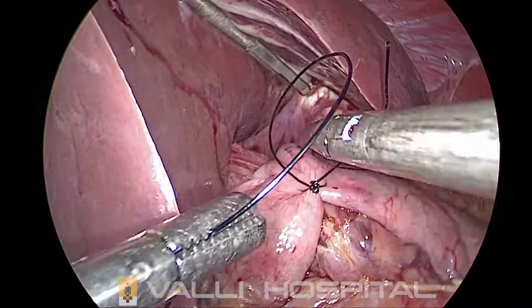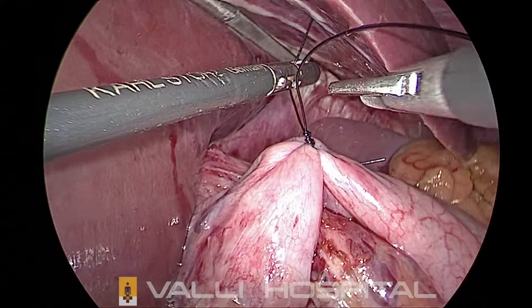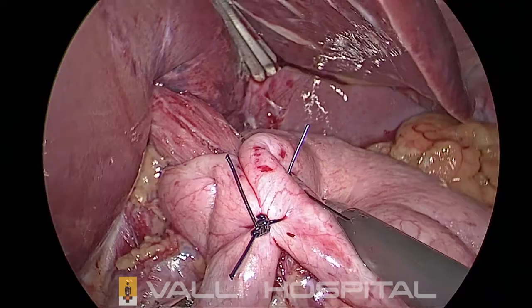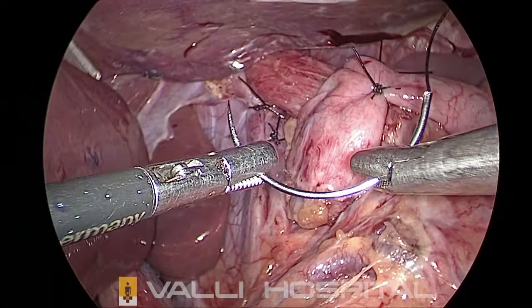That completes the wrap. At the end, you must be able to insert a 5 mm instrument underneath the wrap without any difficulty. See, it has to be loose, it should not be too tight. And there must be enough gap. And lastly, we want to fix the wrap to the crus.